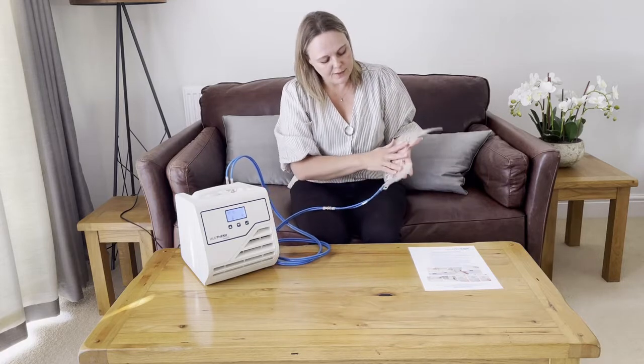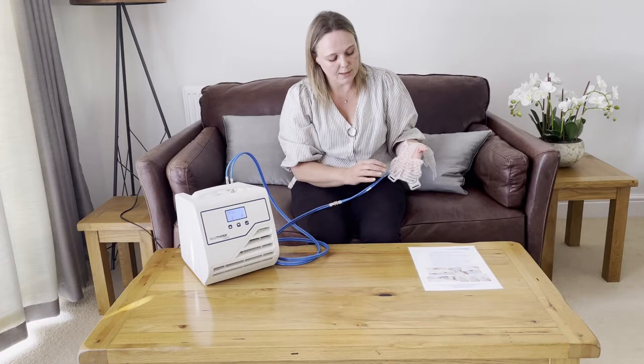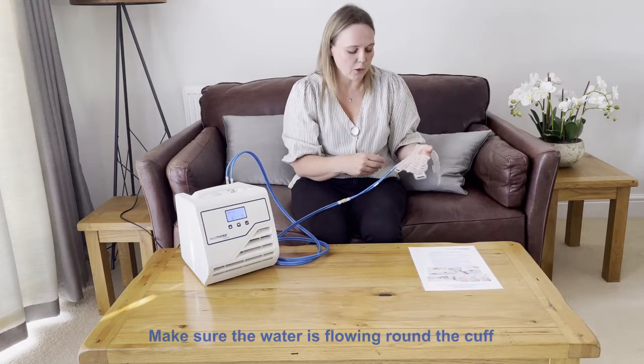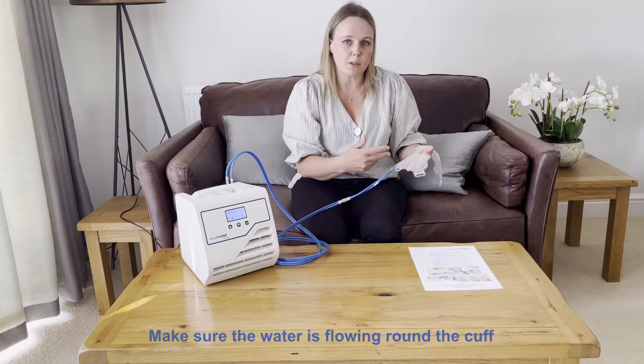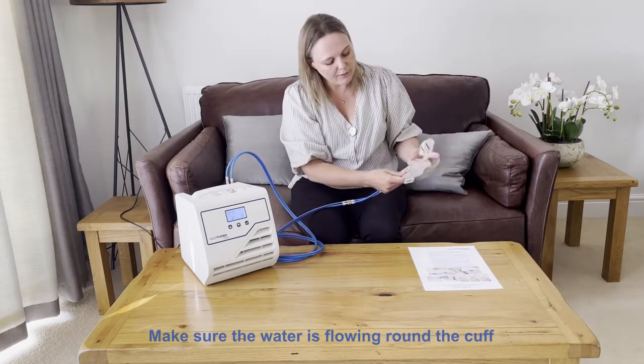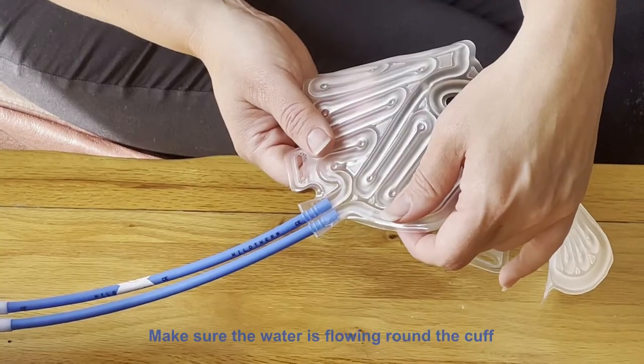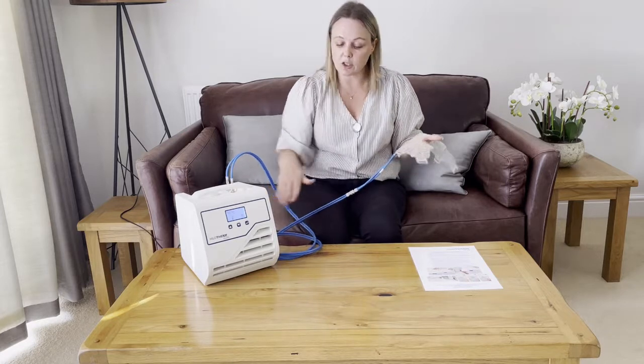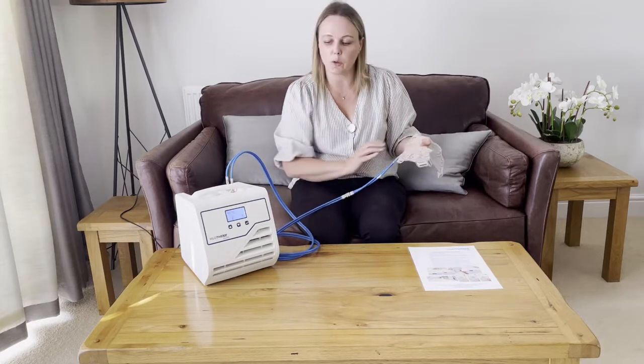We have separate fitting guides for the lower face cuffs and the knee cuff, so please refer to those videos. One of the main things is to make sure the water is flowing all the way around. HyloTherm works by cooling water to a specific temperature then pumping it around the cuff fitted to the part of your face or body. If the water can't travel all the way around, it won't cool effectively. Once you've fitted the mask, check that the water is circulating by feeling whether water is flowing all the way through — check there are no kinks or impingements.